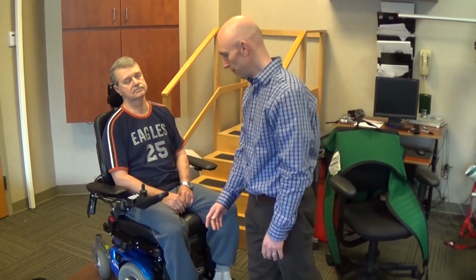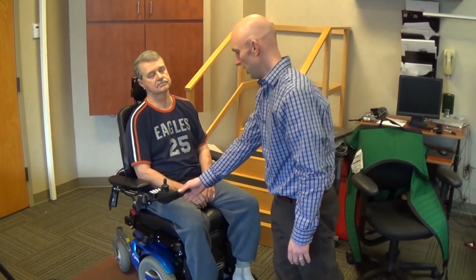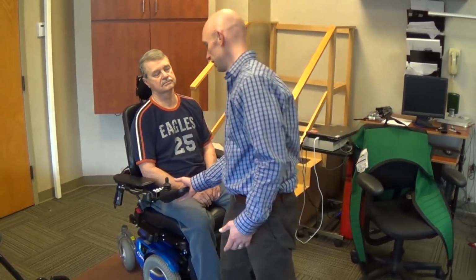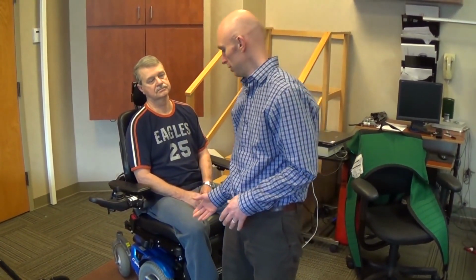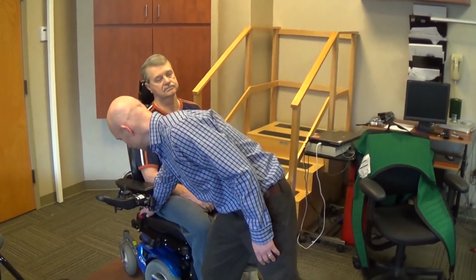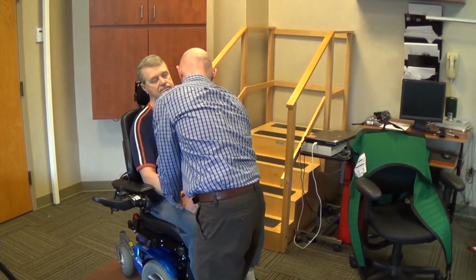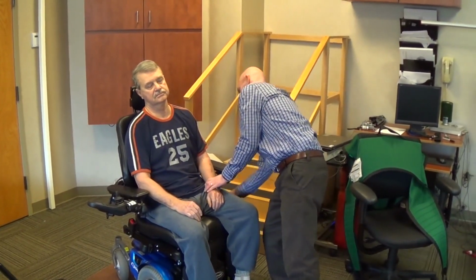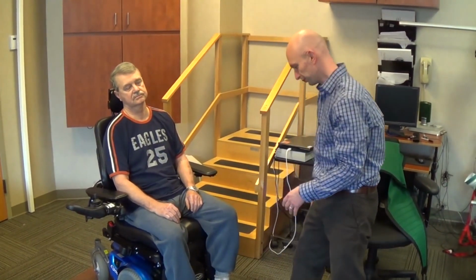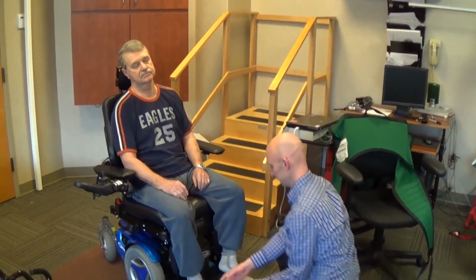First, if they're in a power wheelchair, you want to make sure the power wheelchair is off. And if it has a retractable joystick handle or swing away, moving it out of the way will just reduce risk of damage to the component. Also, making sure the seat belt is unbuckled for the patient once they're securely in a position in the wheelchair. And also lifting the leg rest up.